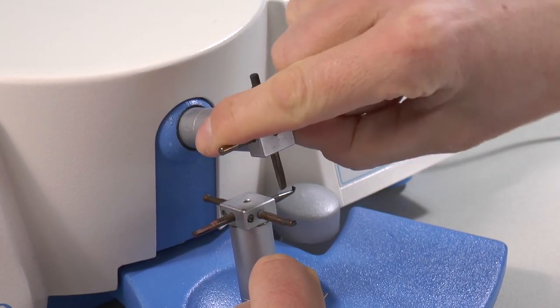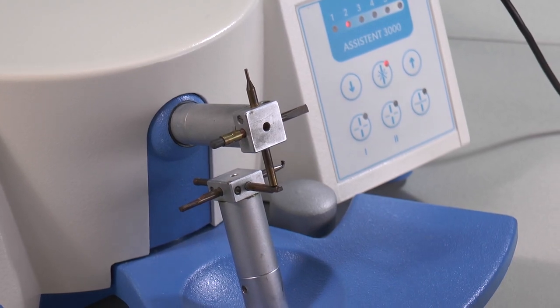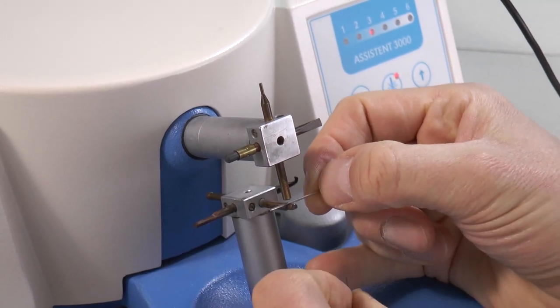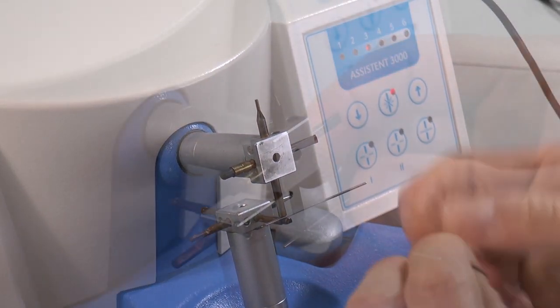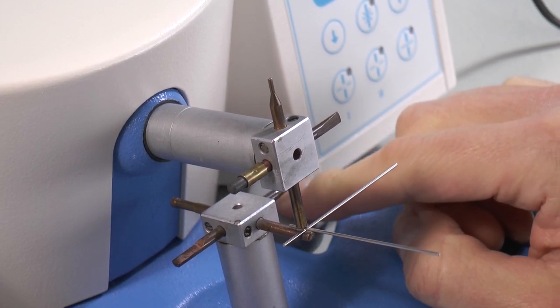Spot welding on wire. This is Remalloy 0.9 millimeter wire. Again I choose the right electrode combination. I can use the foot switch or the manual button.